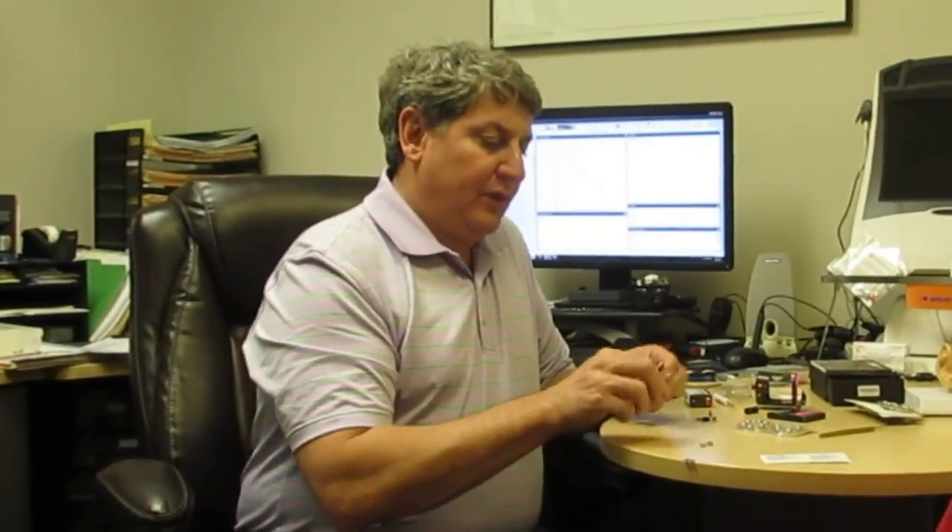Worst case scenario, you have to throw it in there because you're in the middle of a meeting or a wedding or a favorite TV program. You won't harm the instrument or the battery — you just make it a few hours less life. So if I put the hearing aids in when I wake up in the morning and I take them out when I go to bed at night, how often do I have to change batteries? Probably once a week.